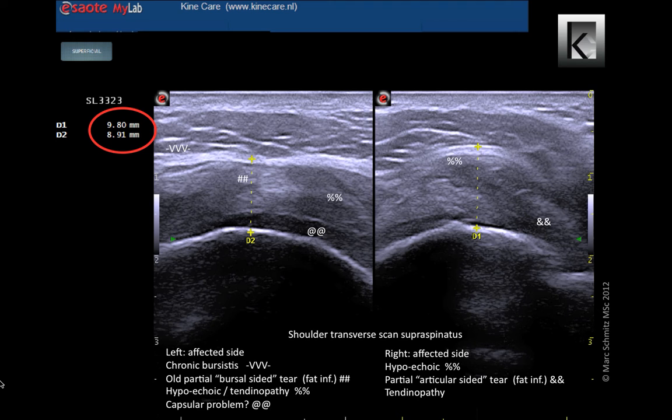The left-sided complaints have been present since two years. An older partial tear seems to be repaired with fatty infiltration. This influences the loadability of the tendon and thus the training load we should apply. The bursa seems to be chronically irritated and the glenohumeral capsule appears to be swollen.